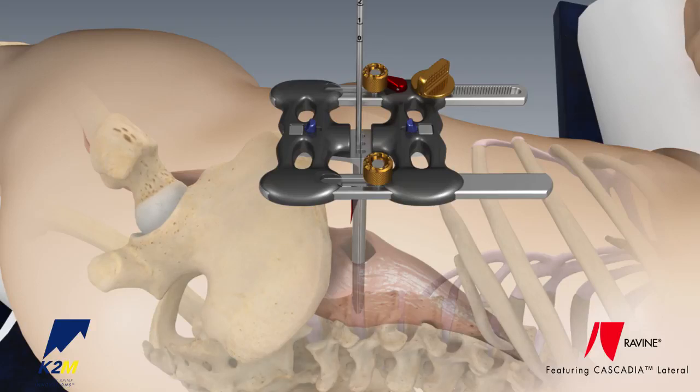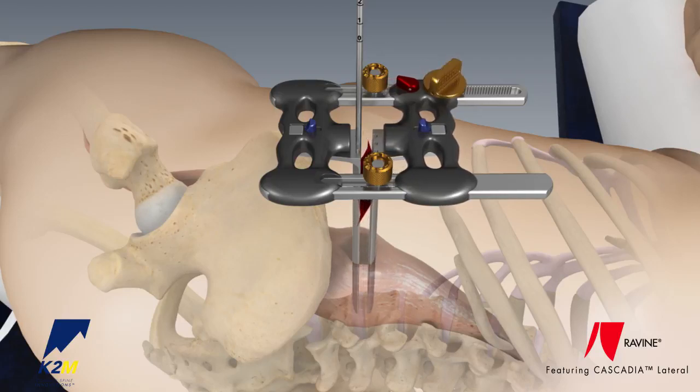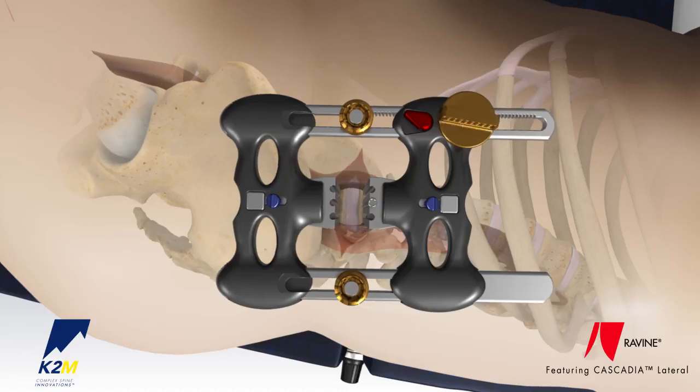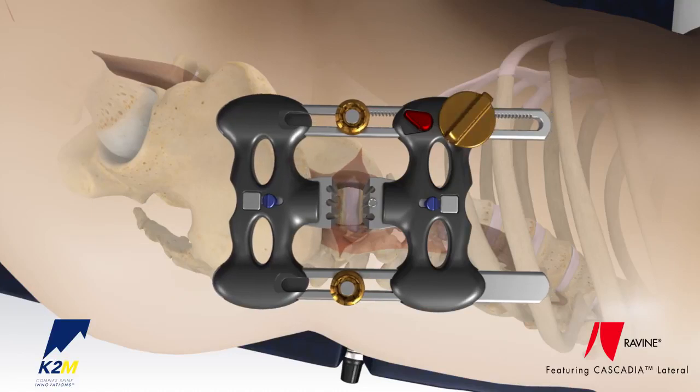Once lined up appropriately with the end plates, the frame is retracted open so the free blade, the one not capturing the guide wire, is directly over the adjacent vertebral body. The corresponding fixation pin is introduced into one of the blade channels and is advanced into the vertebral body using the provided driver. Next, the guide wire is removed and the retractor frame is further retracted open until adequate access and visualization of the disc is attained.